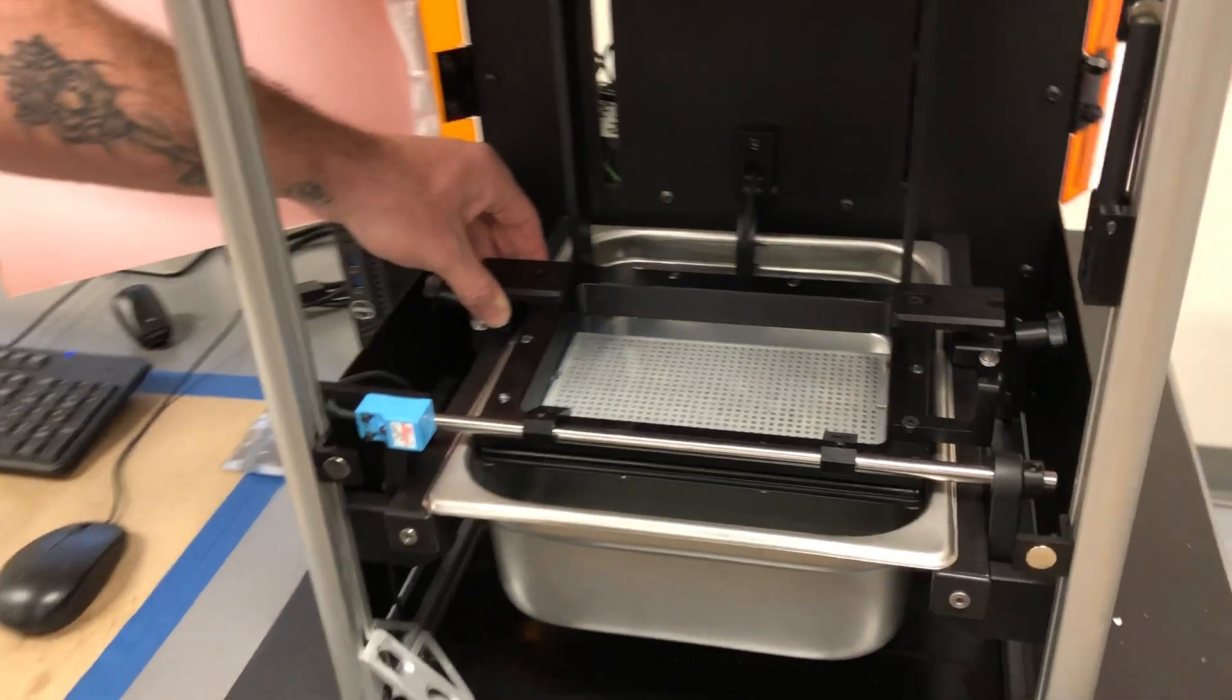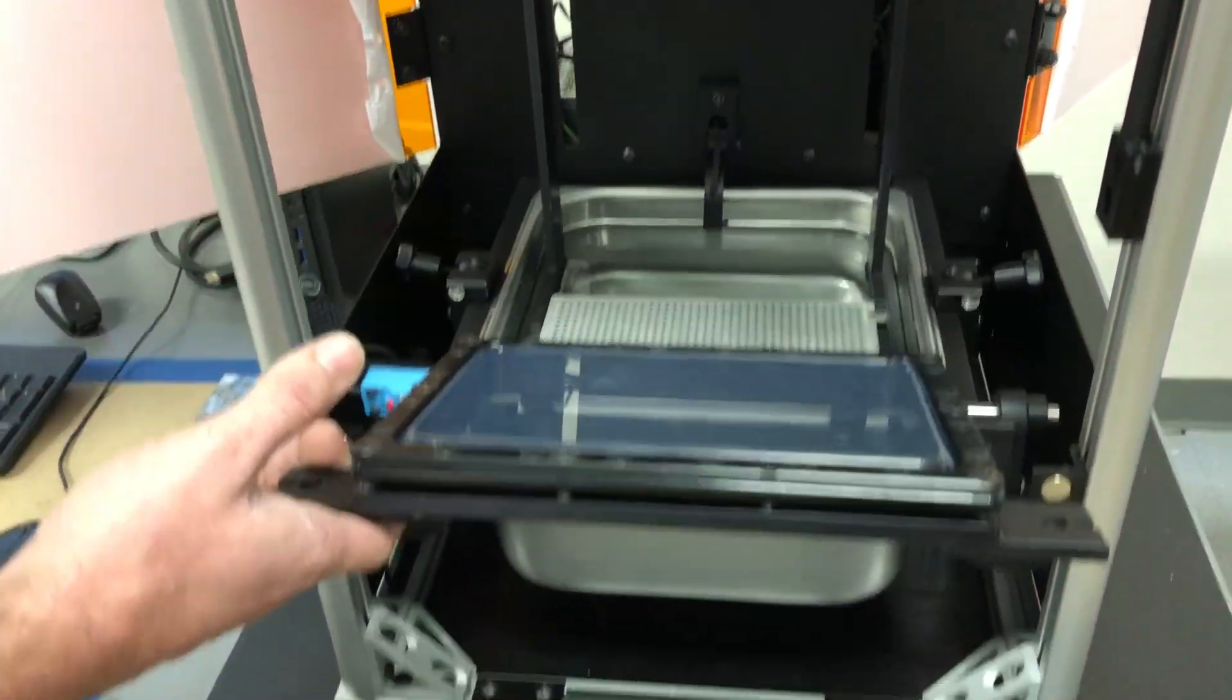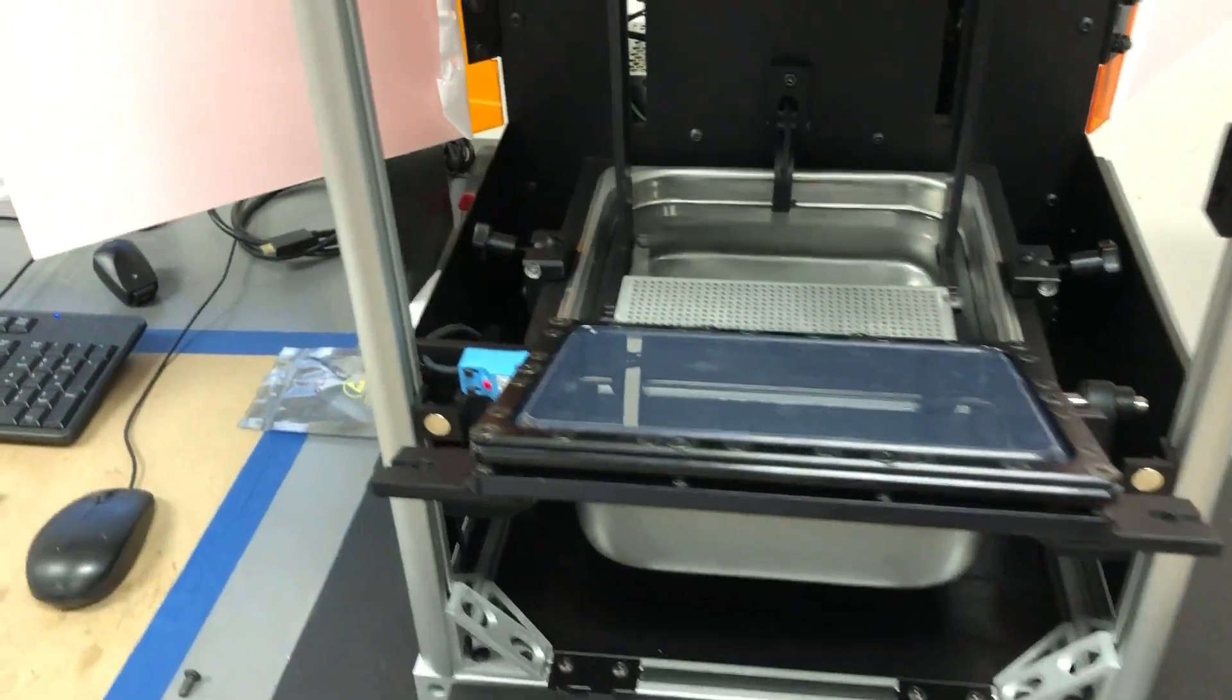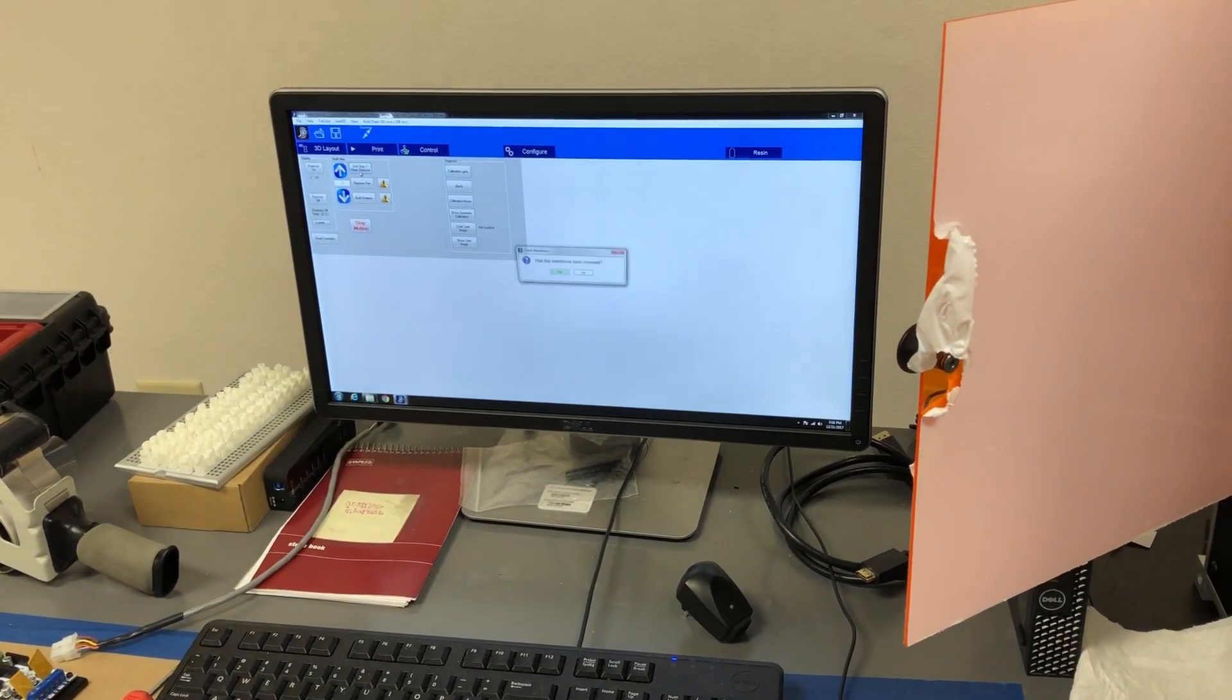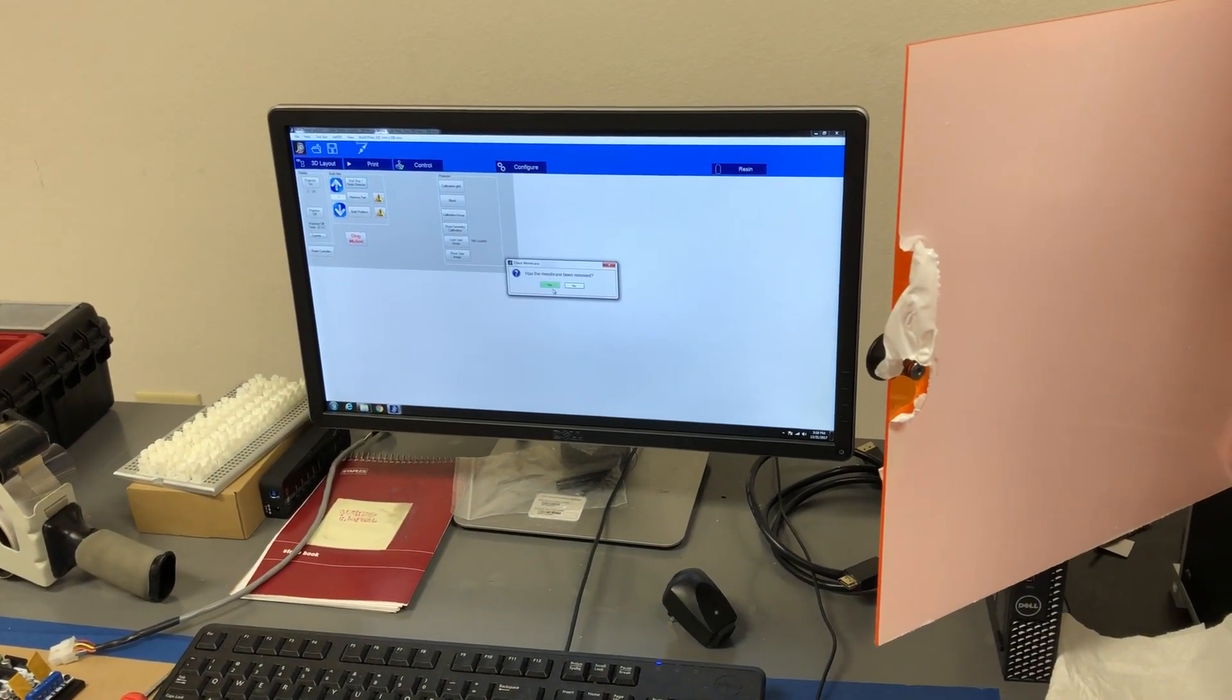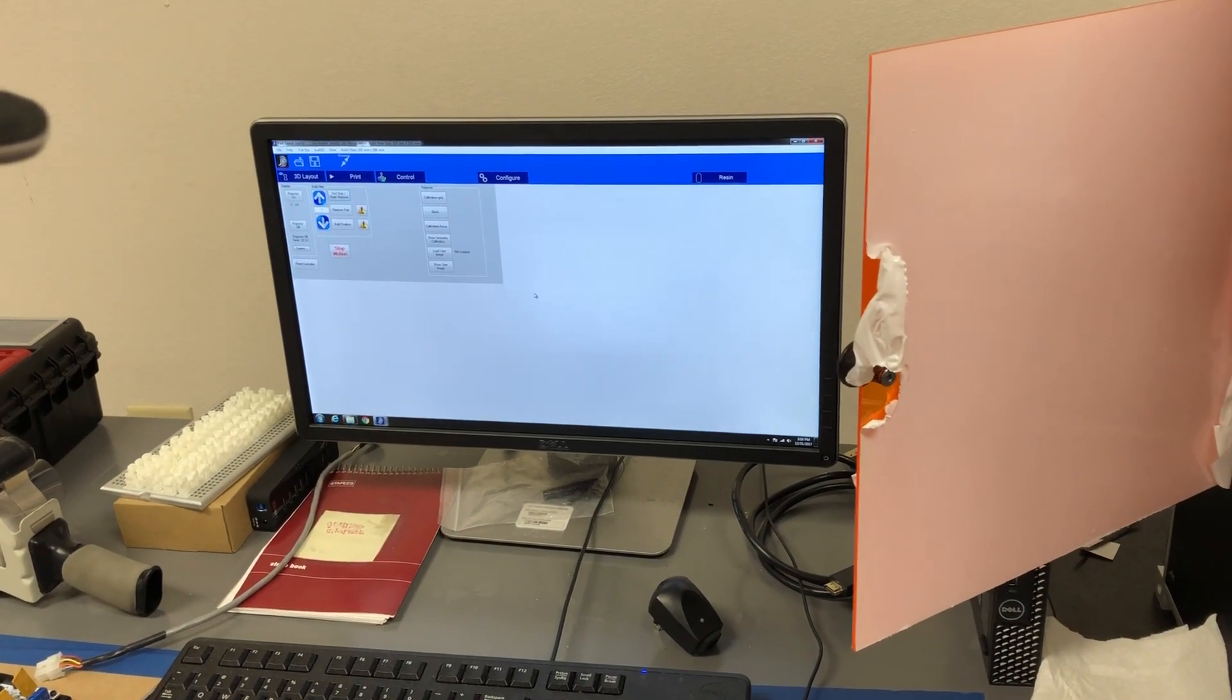So we'll do the same thing, we'll put the membrane out of the way, go back into the software and press end stop resin remove. The membrane is out of the way.